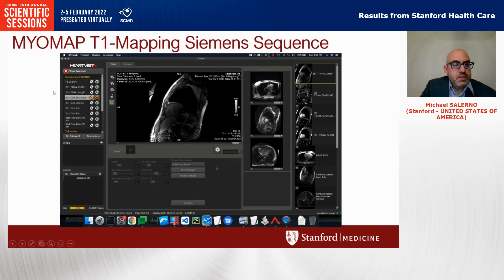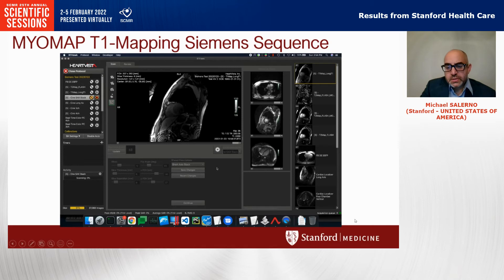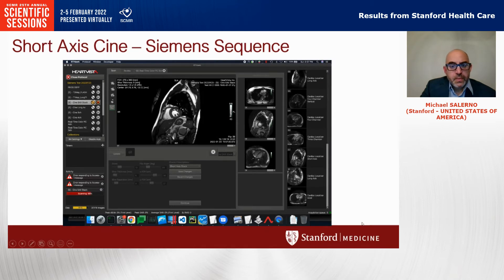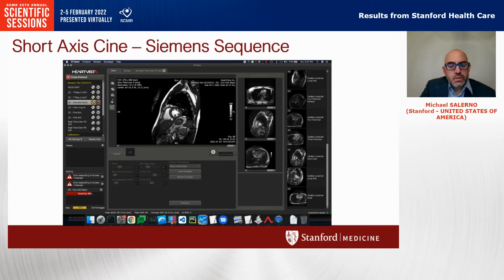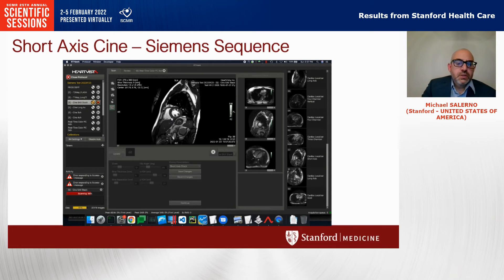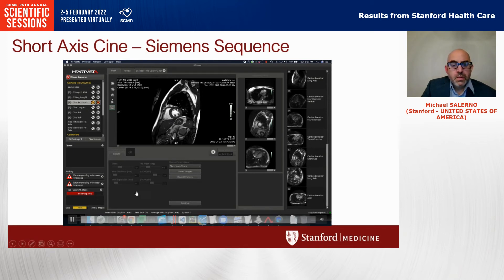The next thing to be run is the CINE short axis stack. Again, this is going to be done using a Siemens sequence. Here's one image of the stack, acquired in the standard breath-held CINE sequences — the patient is getting their breathing instructions and then the scanner picks up again to acquire the image.